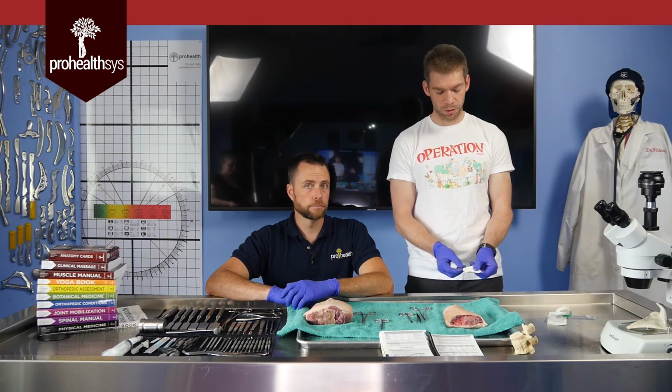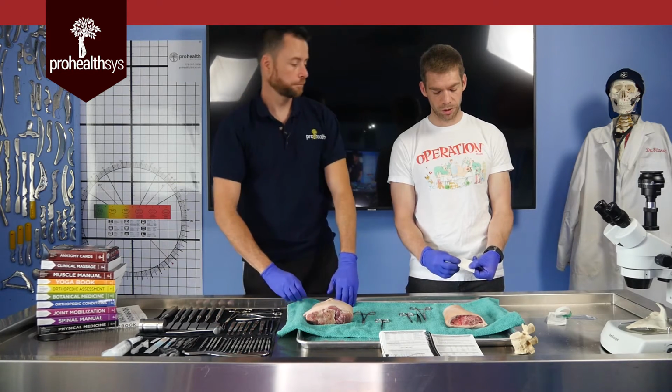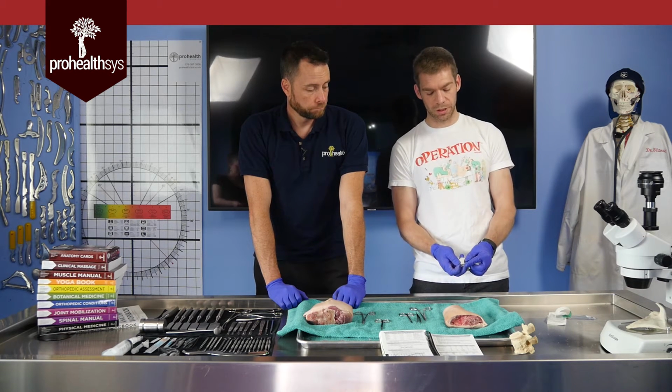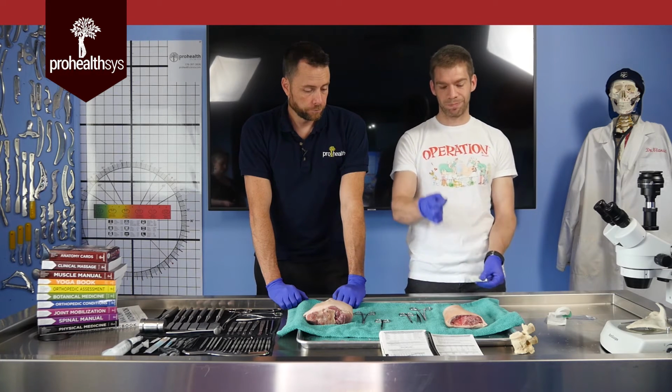Now, you are allowed to touch the back end of the needle near where it joins the suture material. It's impossible to handle if you don't, but never touch the tip. That is finely honed surgical steel. It will go through your glove, it'll go through your skin. It's unpleasant. So I'm going to pull it out.